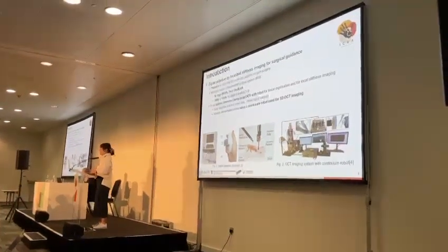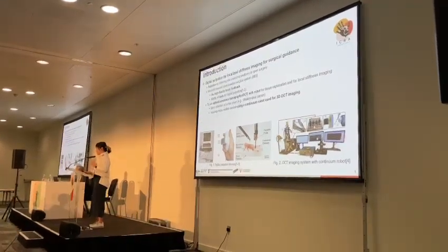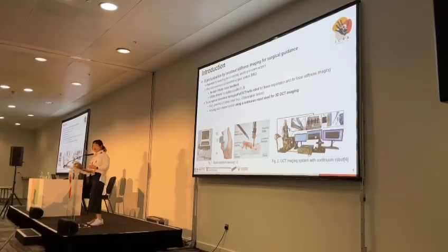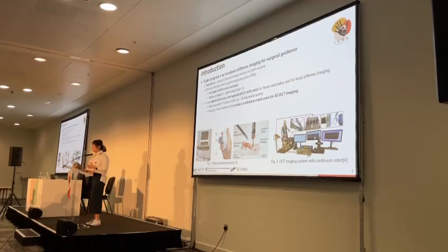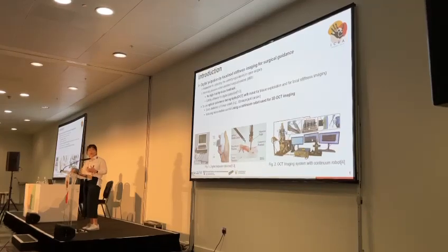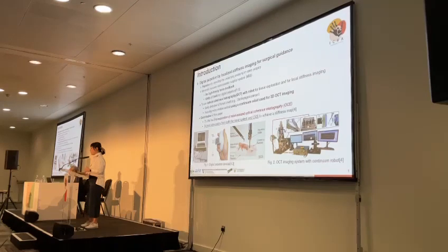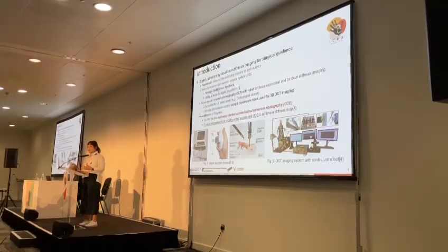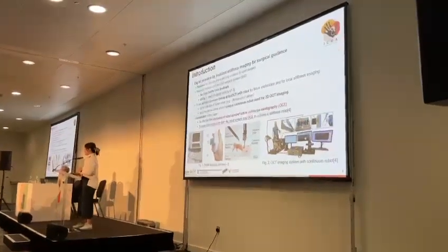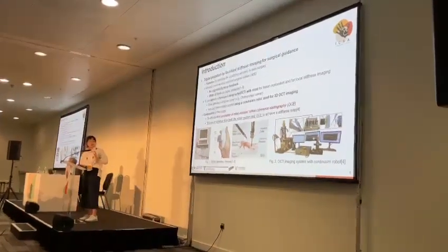Recently, there has been interest in the ophthalmology community in exploring the feasibility of using OCT for tissue exploration and local stiffness imaging to enable early detection of tumor onset. Also, the feasibility of inducing micro motion control using a continuum robot used for 3D OCT imaging was introduced. The contribution of this paper is to offer the first exploration of robot-assisted optical coherence elastography to leverage information from both of these technologies to achieve a stiffness map.